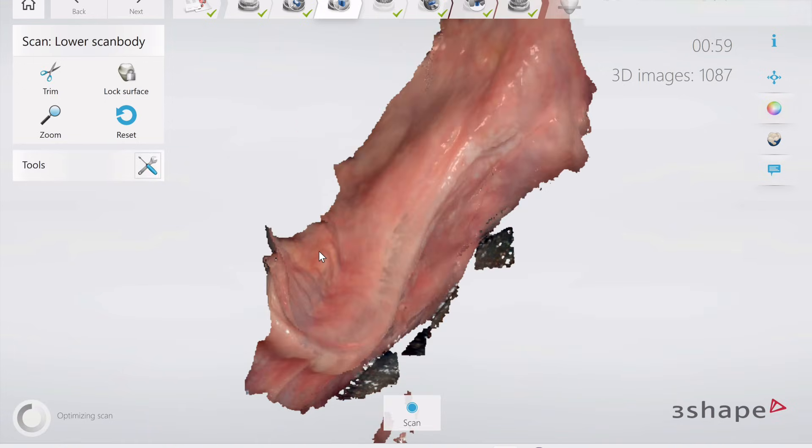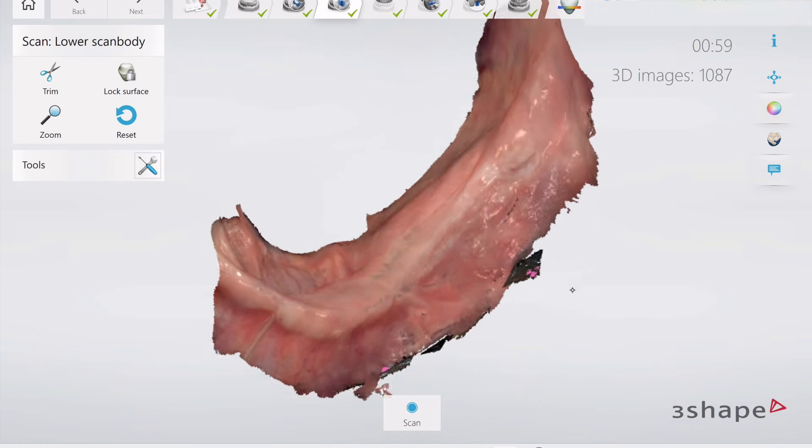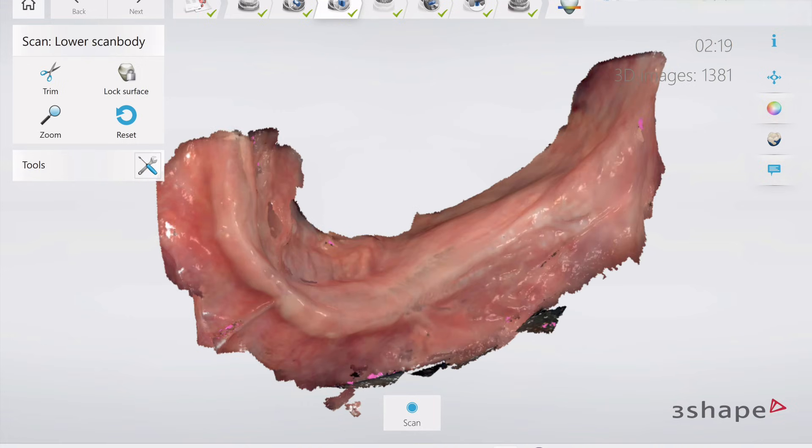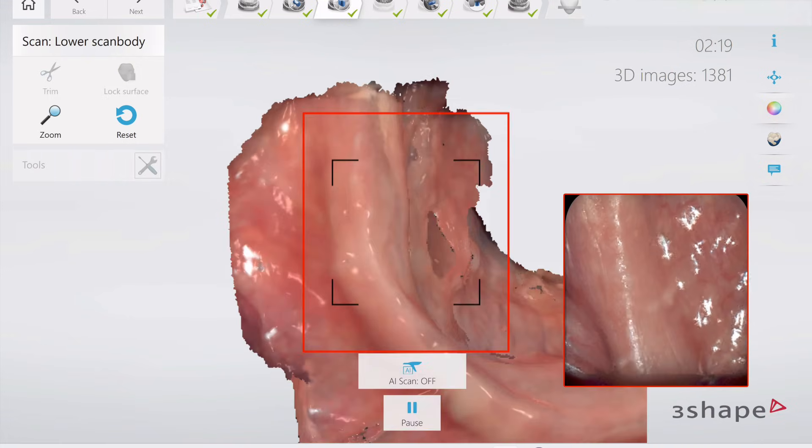So once we get to one side, we're going to then switch the tips on the retractors. The Mod comes with interchangeable tips for right and left side. You're going to click out the left tips, pop in the right tips — and that's what I'm doing right now — and then we're going to go ahead and do the other side starting at the midline.